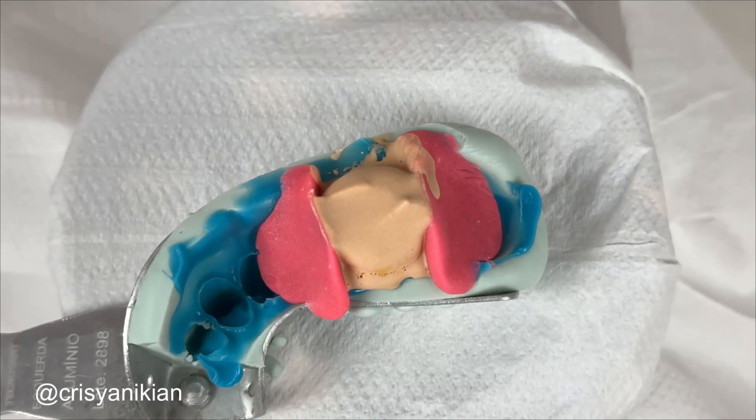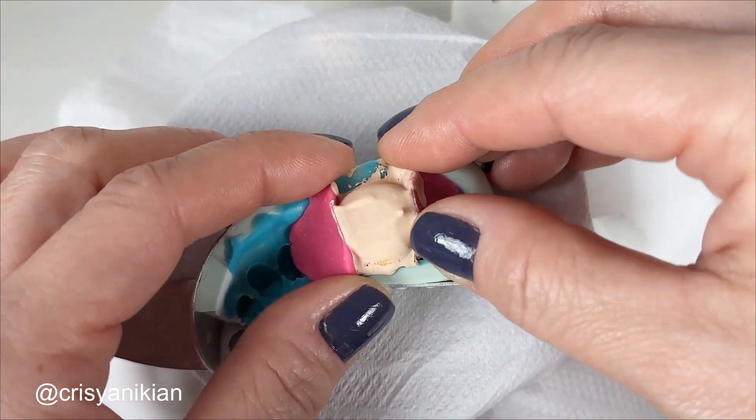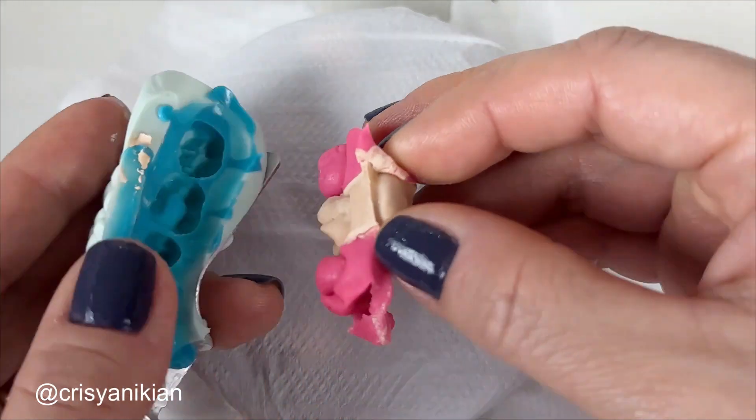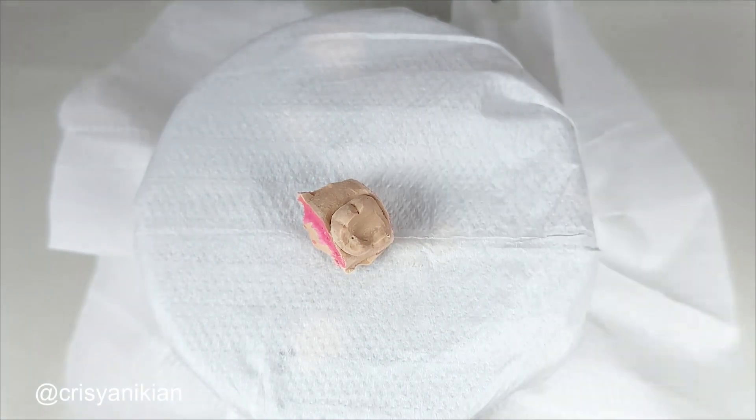Wait for the plaster to crystallize before removing the die from the mold — this will take around 50 minutes. After the crystallization time, carefully remove the plaster from the mold and remove the modeling clay that is stuck to the plaster. Note that we obtained the model only from the prepared tooth.